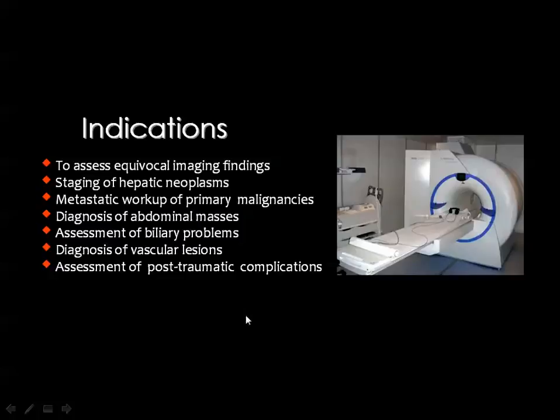You remember that in the previous days, most of the patients with abdominal trauma would go directly to the surgical department for exploration if they had a suspicion of internal bleeding, for example. But nowadays we can image the patient in a few seconds using the multi-detector CT, assessing different abdominal organs, and we can see the bleeder. This will be presented in a separate lecture which will deal with abdominal trauma.